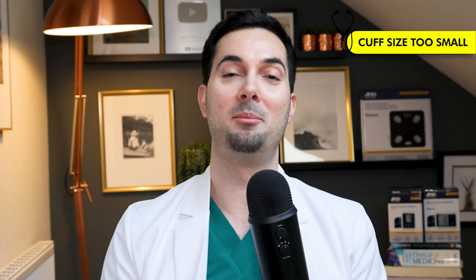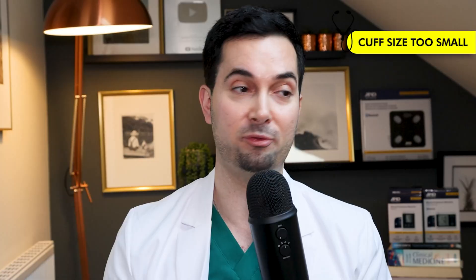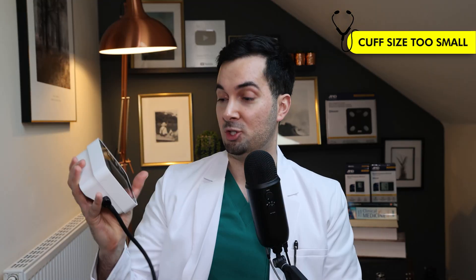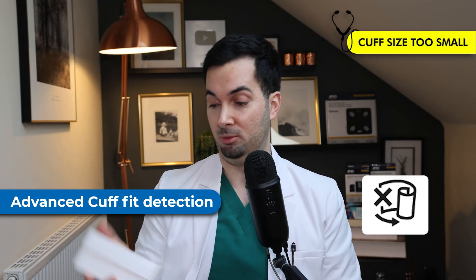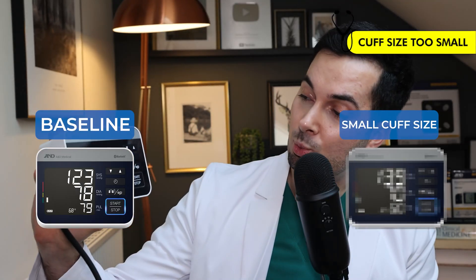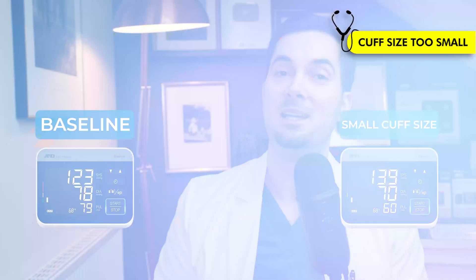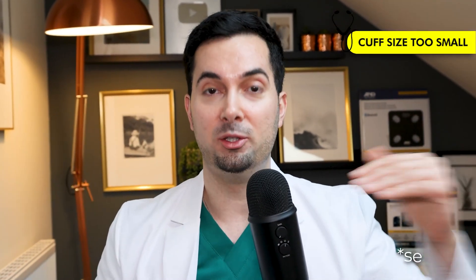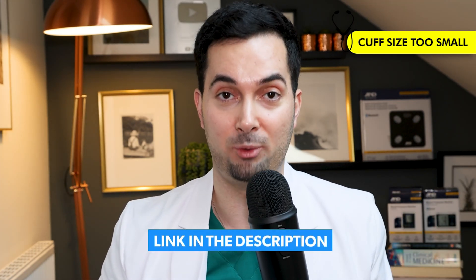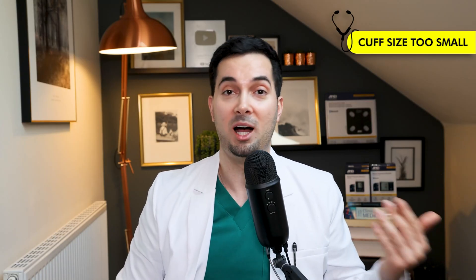Results for experiment two — the small cuff size. Honestly, it was quite painful having my blood pressure done with such a small cuff. The UA-910BLE monitor even came up with a cuff size detection warning, which was really helpful. Remember, baseline was 123/78. With the small cuff, blood pressure went up to 139 over 70 — 139/70. As you can see, having the wrong cuff size massively increased the reading, giving us a false higher result. Make sure you check your cuff size.